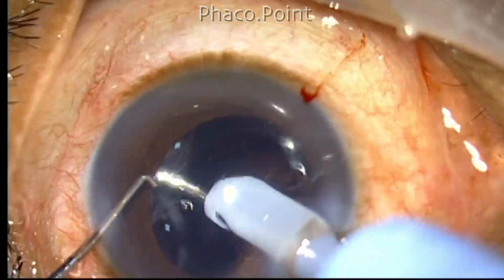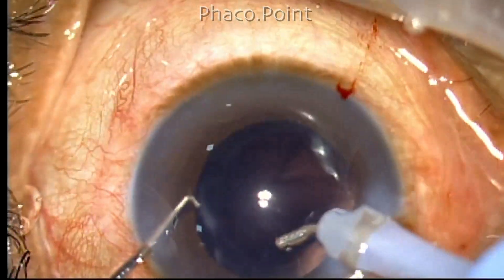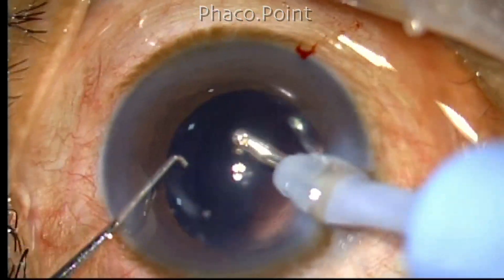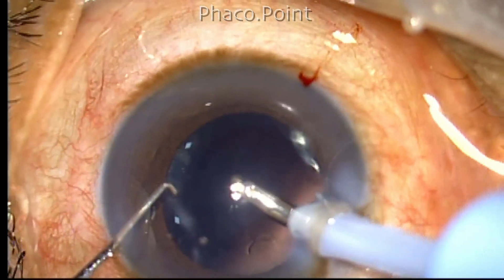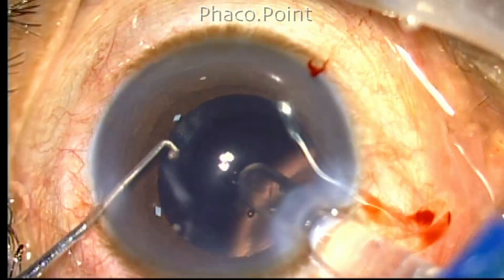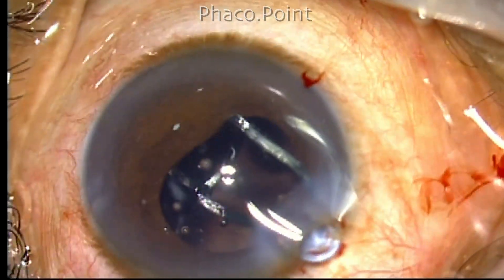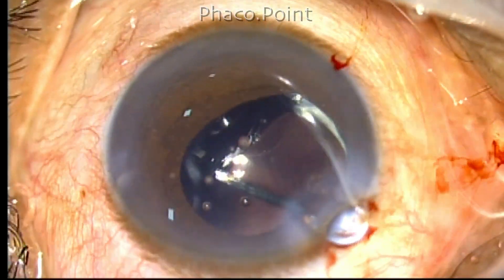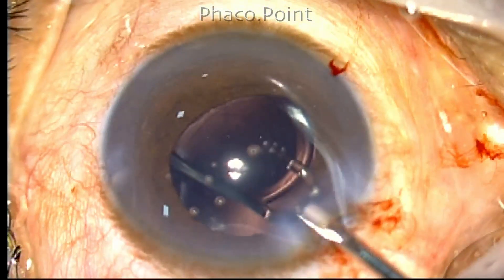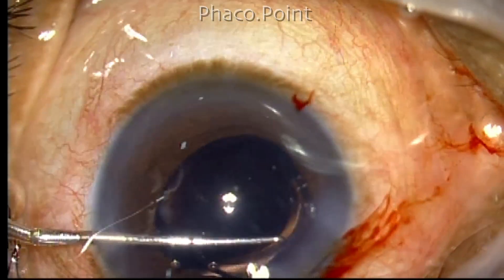It is important to understand that a good cortical cleavage hydrodissection is imperative to achieve rotation of the nucleus. Rotation of the nucleus is important in phaco because we need to position the fragments diametrically opposite the side of incision in order to apply maneuvers like trenching or a direct chop. While the intraocular lens is injected, there is a kind of IOL shoot — probably because the lens is a little rigid — but no serious damage has been done, and the intraocular lens is carefully maneuvered and implanted inside the capsular bag.